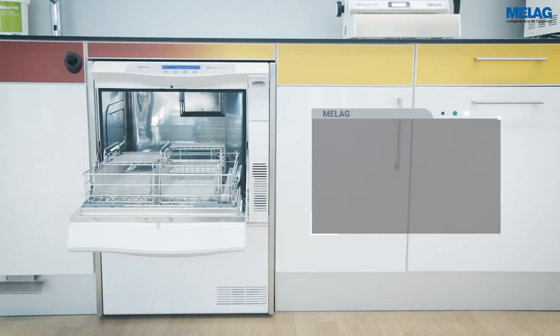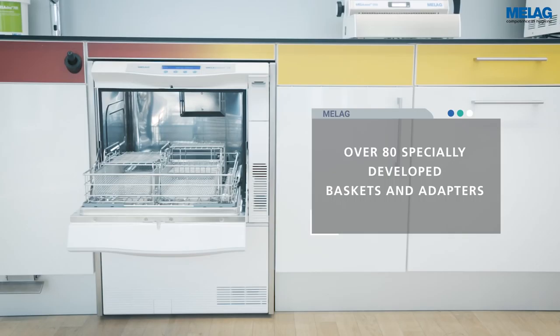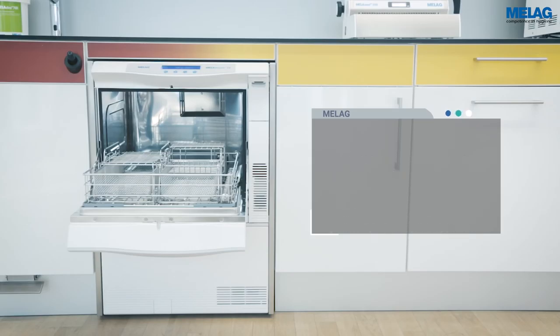With over 80 specially developed baskets, the practice-optimized treatment chamber of the Milotherm 10 can be matched to the individual needs of an ENT clinic.